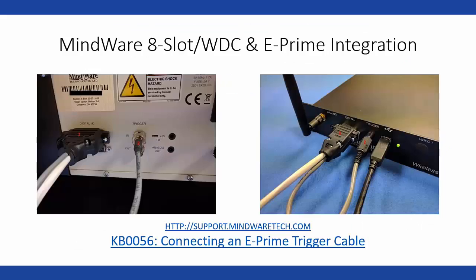We do have a newly created knowledge base article that you can find within our support site. If you go to support.mindwaretech.com, there's this knowledge base article number 56. It has very good pictures and step-by-step instructions of where the cable plugs into on the PC and on your chassis, and where the trigger goes and things like that. So please view this knowledge base article following the webinar if you have any additional connection questions.